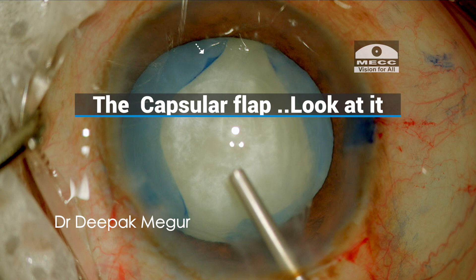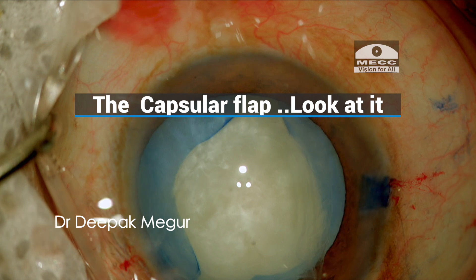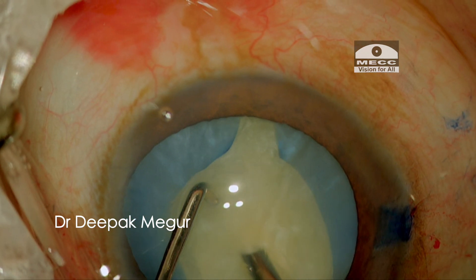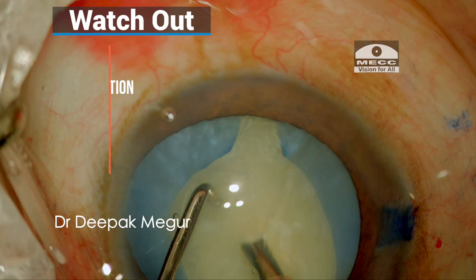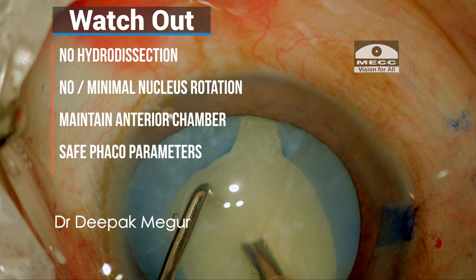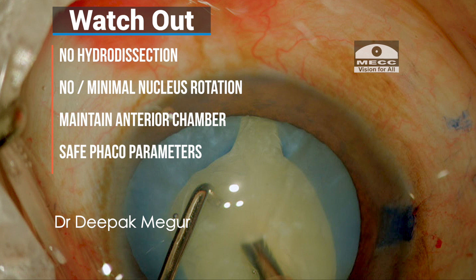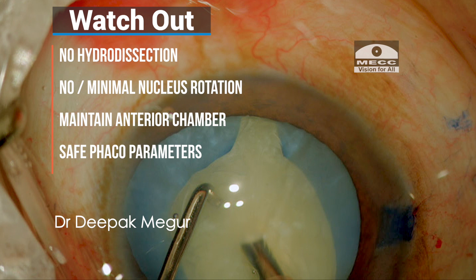Most importantly, the visibility of the intact anterior capsular flap was quite good. The intact anterior capsular flap has great clinical significance which I will be describing shortly. Before beginning the FACO, I must ensure that these principles are duly followed during nucleus emulsification: there should be no hydrodissection, no or minimal rotation of the nucleus, and always maintain the anterior chamber very effectively by using safe parameters.